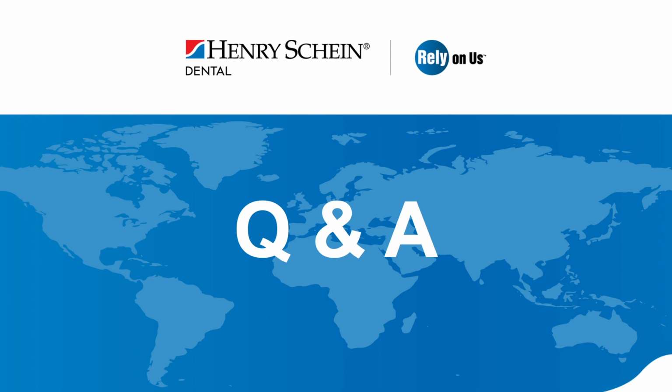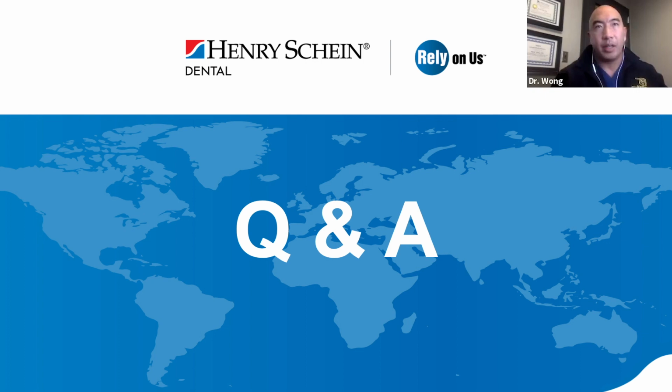Is the Vulcan custom abutment made from an impression taken prior, or is it just based on the tooth number? Okay, so it's based on the CBCT. Whenever you send in your CBCT and your models, how it works is you either send in an actual model, a scan of a model, or a digital scan, either way. And they digitize it and overlay the model with your CBCT, and that's how they know the size and the shape of the tooth. So that's how they do it, based off the models that you send.